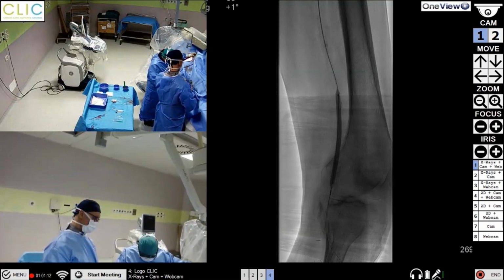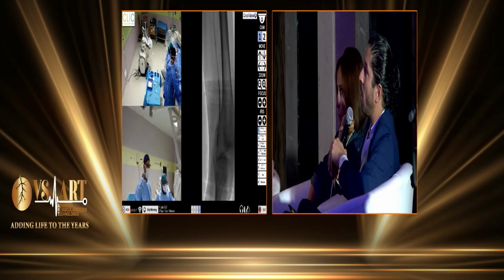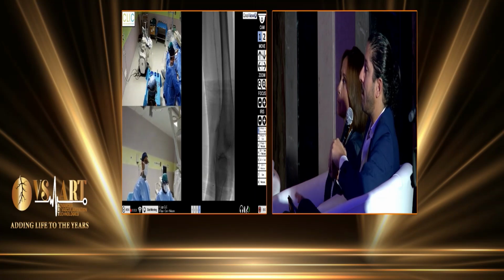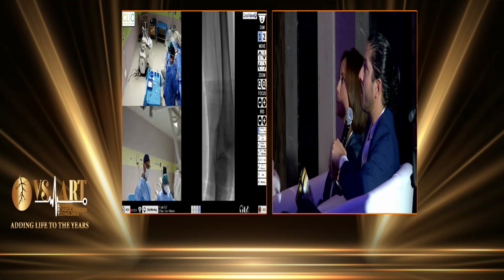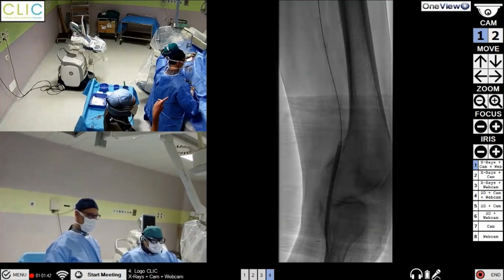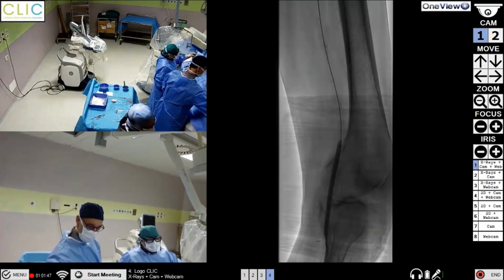I have another question related to the foot angiography, Marco. When you showed us the foot angio by CO2, it seems that the gas was arriving. When you showed us the angio by iodinated contrast medium, it was so poor. So do you believe that the real vascular situation is so poor, or are we in front of a big spasm of the residual patent arteries in the foot? I had that suspicion, to have a spasm for the CO2.